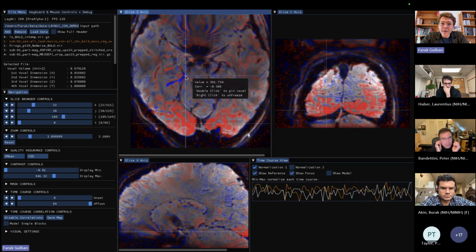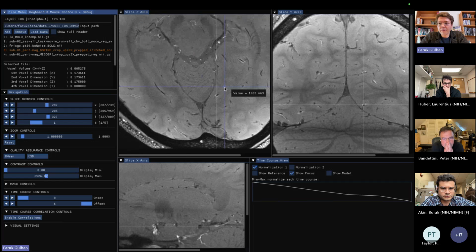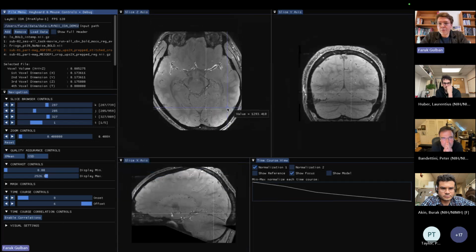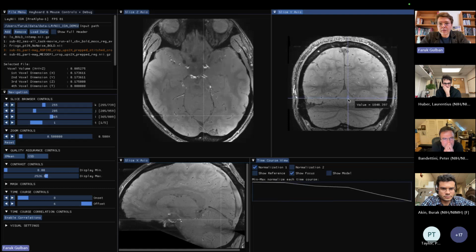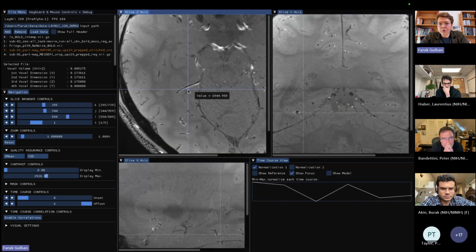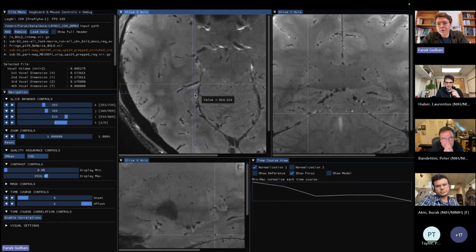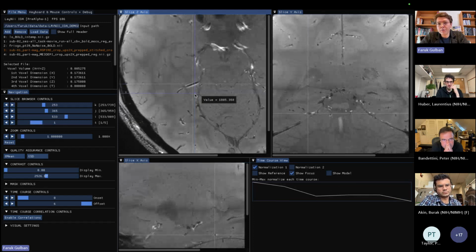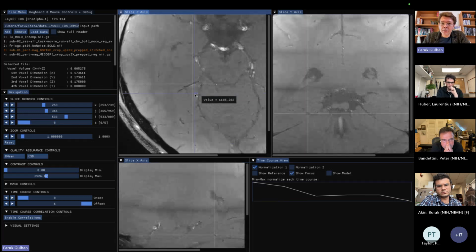And when I see that snake, I recognize that this is actually an artery that I am used to seeing in this subject. Here I'm going to show you the GRE data, that is whole brain, that we acquired. See, this is the snake that I was showing. It's negatively correlated. Now I'm going to move across the time. These are 6 echoes spanning from 3 milliseconds to 21 milliseconds.